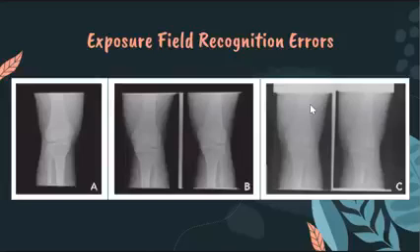So, dapat proper practice is to ano na lang, one projection each plate na lang, bahalag kapoy. Basta, at least, as you can see naman, better naman ang quality of image kaysa sa this one.